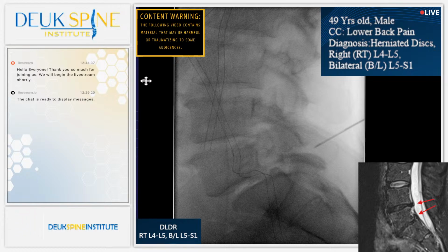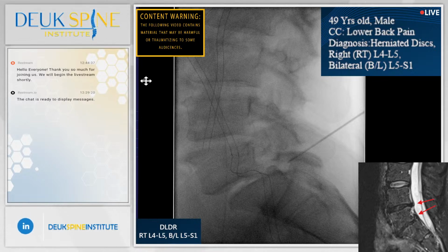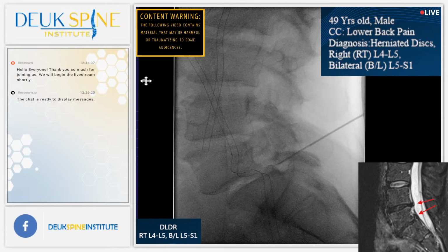All right, so I'm going to work on getting down to the 5-1 disc. Very difficult, but we're going to give it our best, and I expect to be able to get there. In the meantime, Henry, if you want to show our audience why it is that herniated discs cause so much pain, then our audience could understand better.